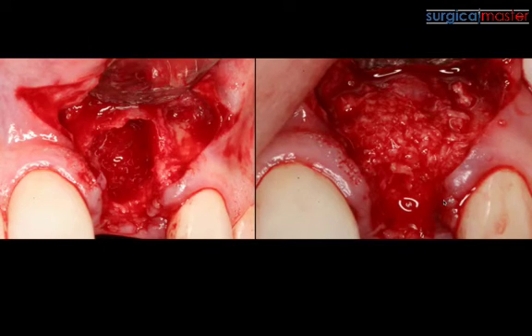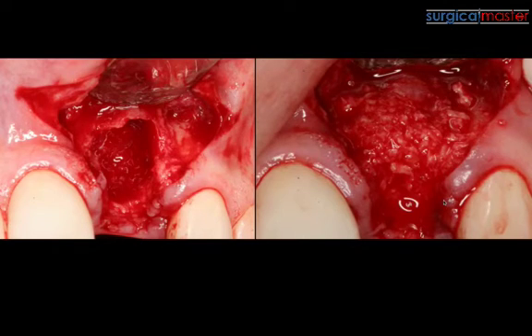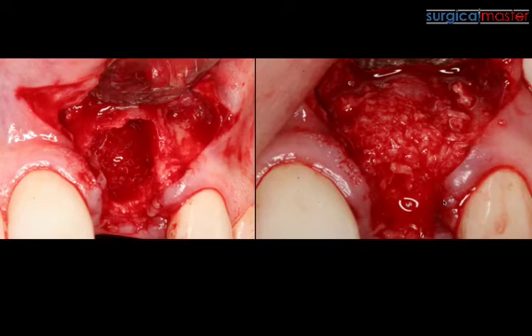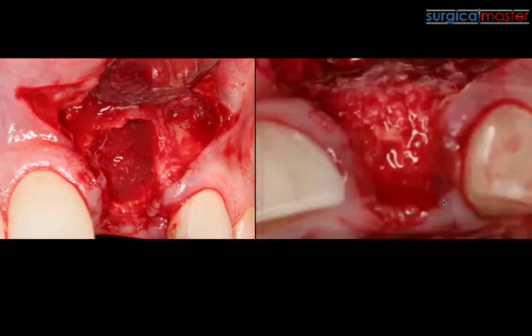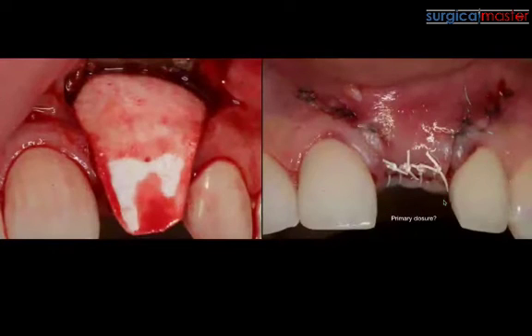We have mesiodistal palatal and half of the buccal plate, and we probably have a little bottom or floor. So what does the compartment technique tell us to do? Graft with moderate force, use a membrane, graft in excess if you can, use a membrane on the buccal.